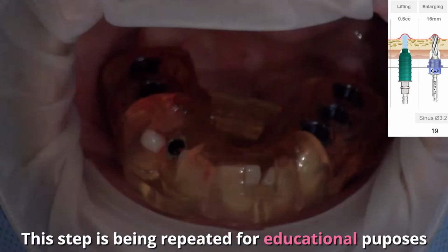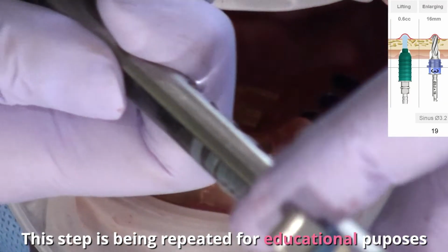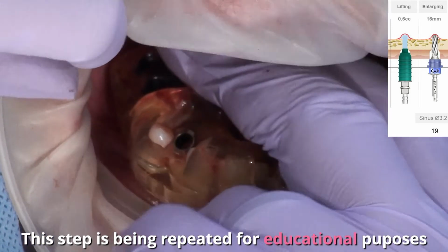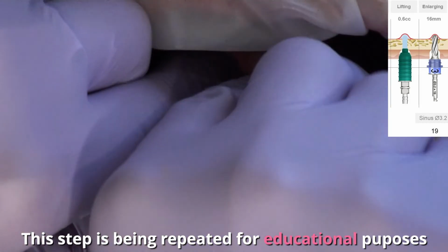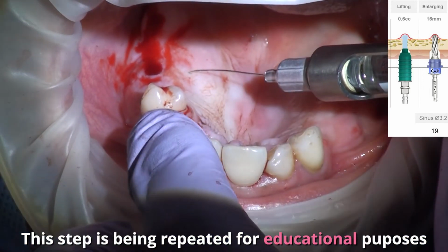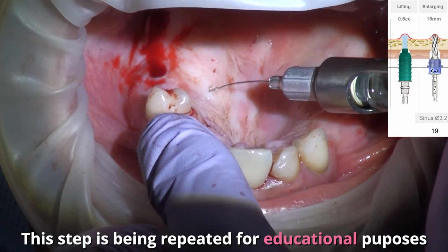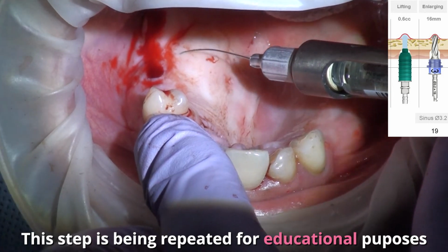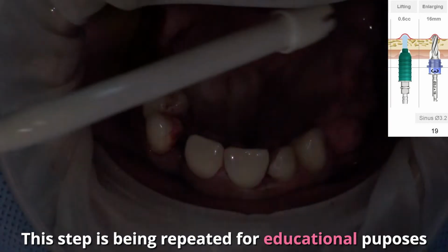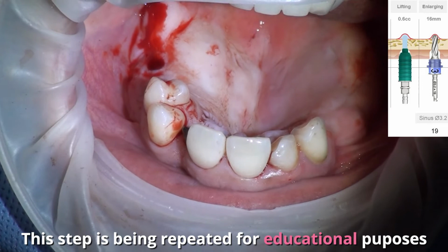Very good. Were you feeling that a little? Uh-huh. Okay, let's take some anesthetic. Let's take the guide off just because it's going to come off anyways. Try to lift straight up. I don't want it to hurt that abutment. Are you feeling any of that right there? Okay, good. I think we've got you there. So I've just drilled a little bit more.